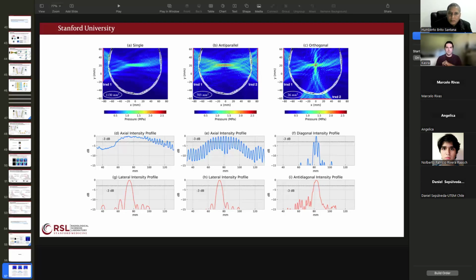Vladimir, thank you so much for the question. So that temperature rise is actually, yeah, a great question. In my talk, I only talked about neuromodulation, and the intention there is how can we interfere with the way neurons are firing? Either we want to repress them or we want to excite them, stimulate them, one way or the other. To do that, we always keep the intensity low enough that we don't raise the temperature beyond critical values where we're going to burn the tissue.